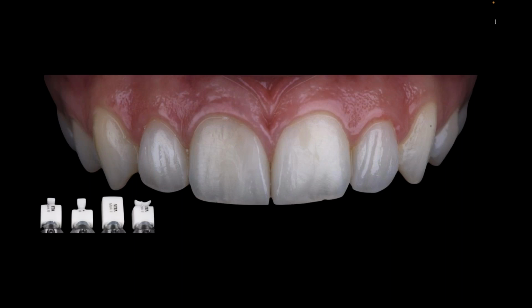So for me, all I'm using that enamel for is a filtration system, right? To give me what I want value-wise, and then I control the value with a little bit of stain there as a monolithic type material in the end.